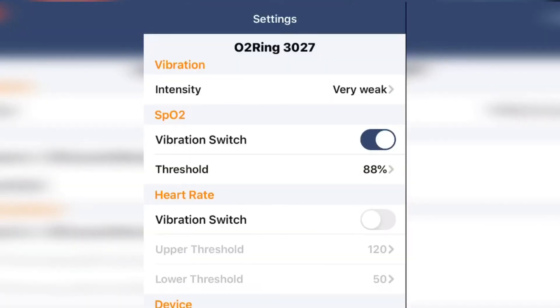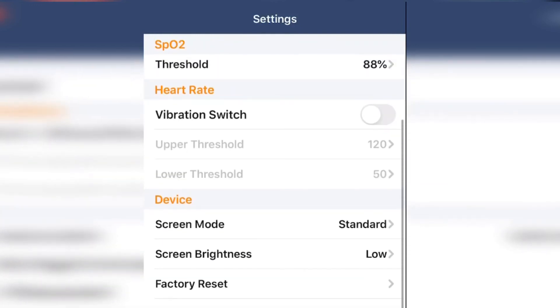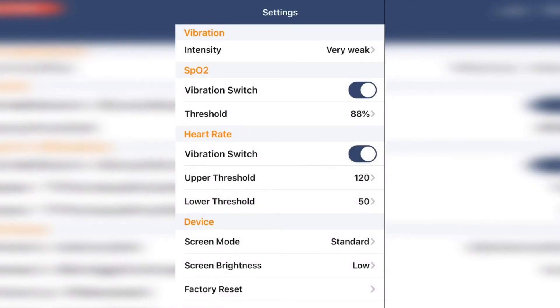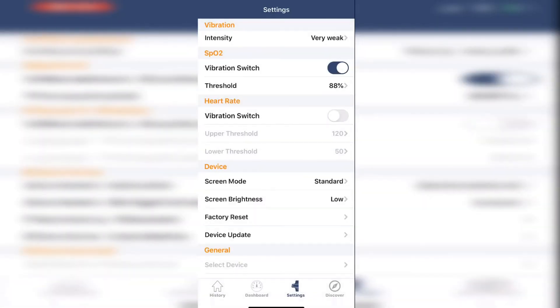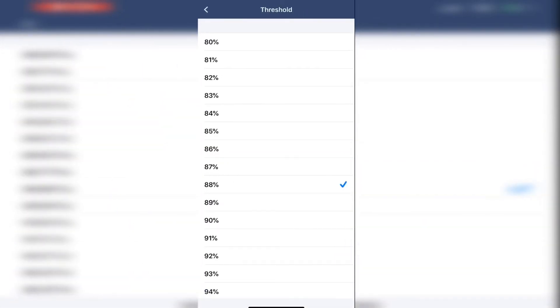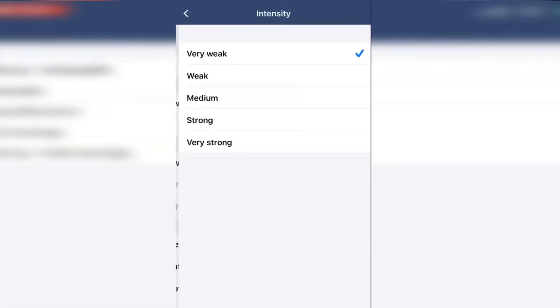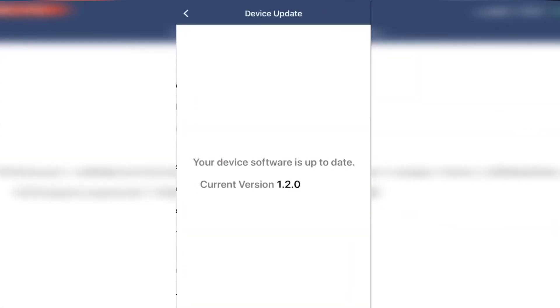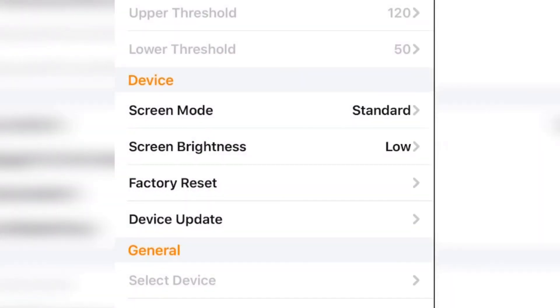Here in the settings you can select brightness and vibration levels. You can also select thresholds for the oxygen and the heart rate, for which the ring will vibrate — you are basically setting the ring to go off as an alarm if something should go wrong. You can also check for software updates.